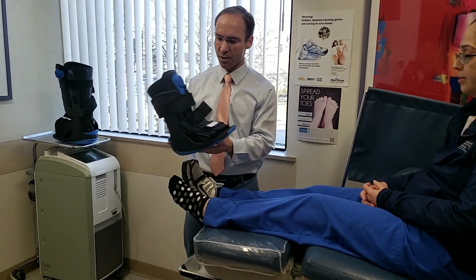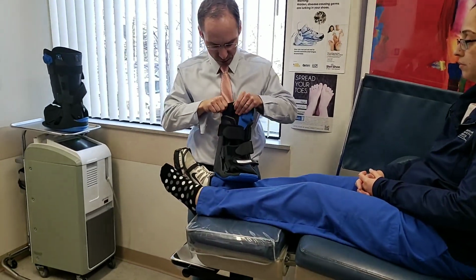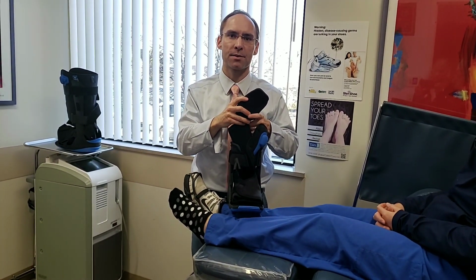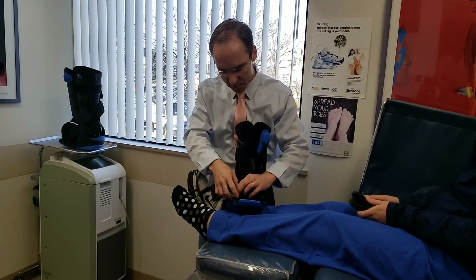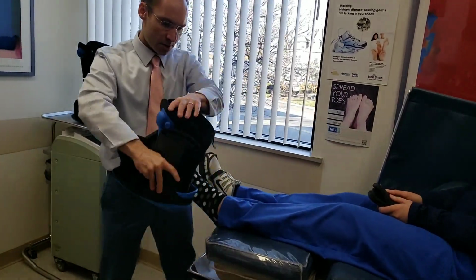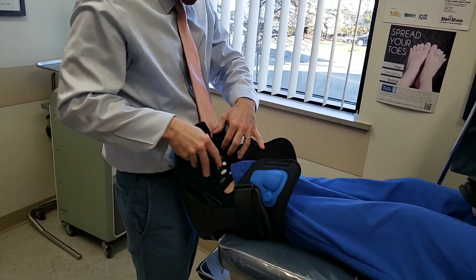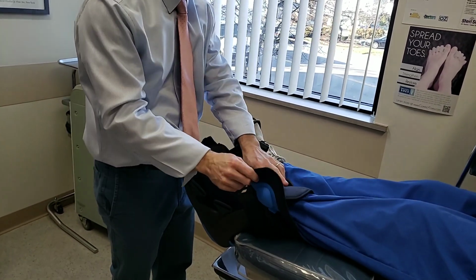When you start to look at your device here, it has these straps on it, and you first have to open these up, and they come with some extra padding. This padding you can use anywhere that you might have a bony prominence. So what you do is you open up the boot, and you have the patient lift up their foot and put the foot right inside the boot, and make sure the pants are down. And then you take these and you strap down the Velcro first.